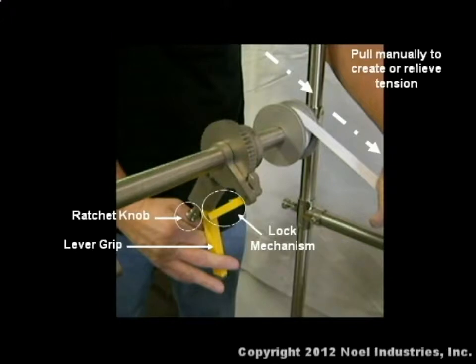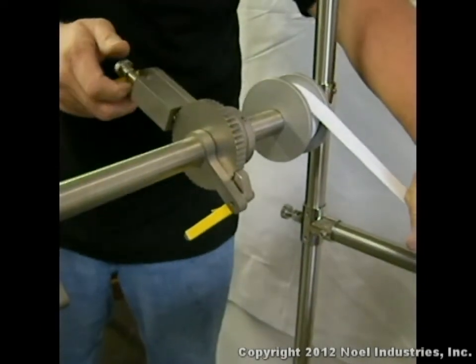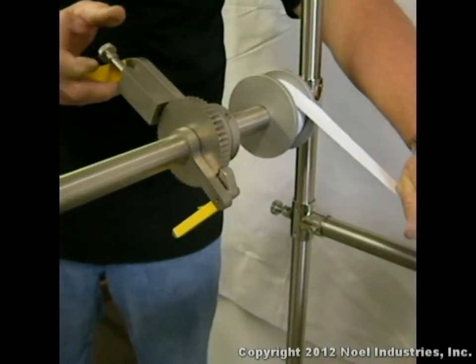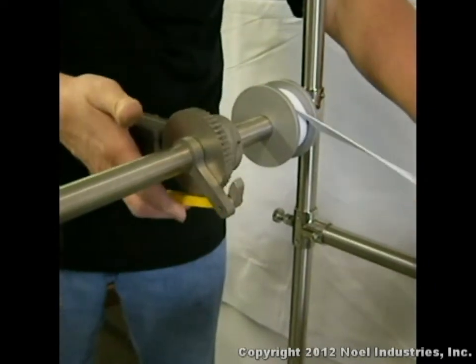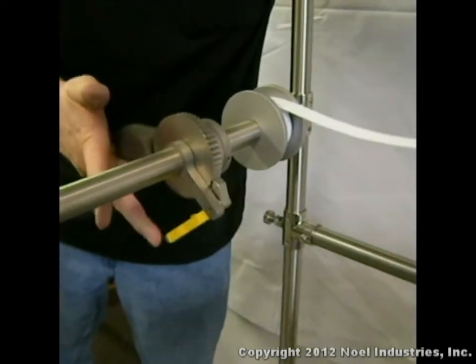Step 1: Hold the strap manually to relieve tension from the ratchet. Step 2: Pull out the ratchet knob and rotate it counterclockwise 90 degrees. Step 3: Lift the yellow lock lever located beneath the ratchet wheel to disengage the lock.